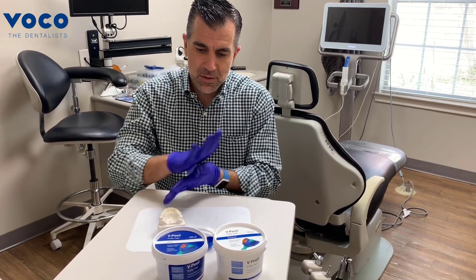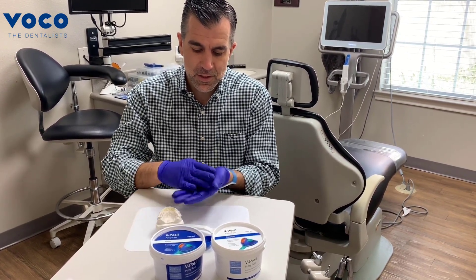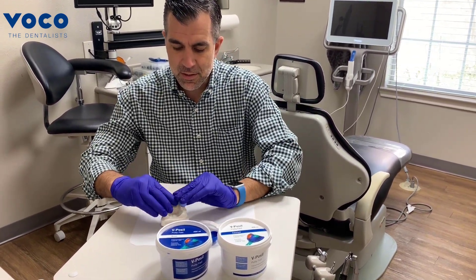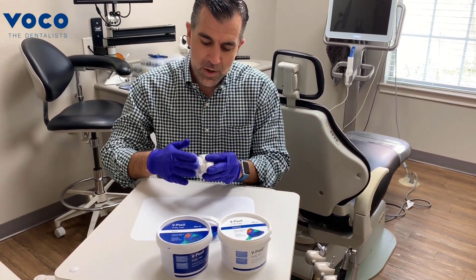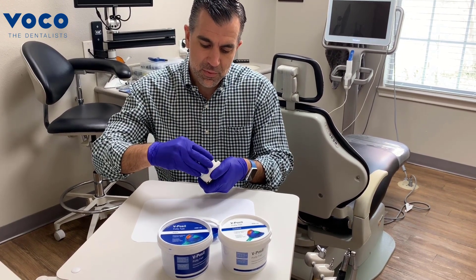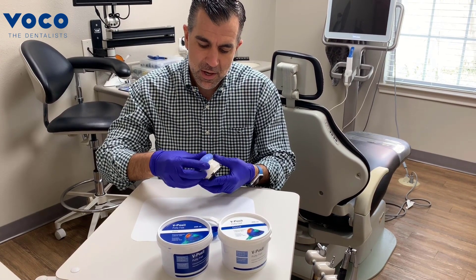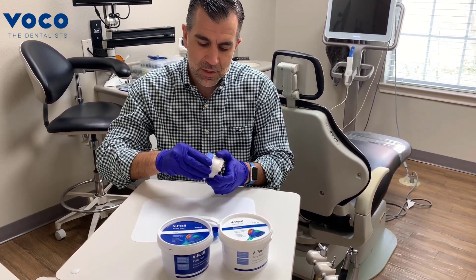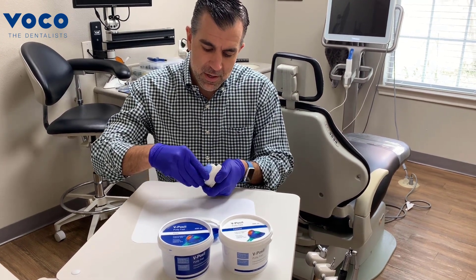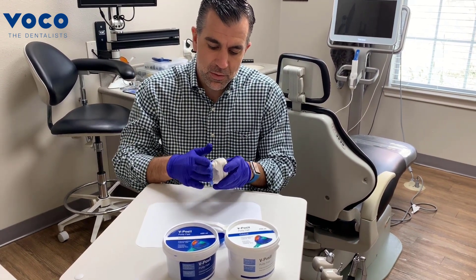Now we've got our putty to a pretty even consistency — you'll notice there's no marbling. I just roll it out and place it on top of the teeth. When you do this, you want to go about one to two teeth behind your planned temporary that you're going to fabricate out of bisacral composite. One to two teeth behind is all that you really need, and I like these to be smooth and adapt very well to the model.